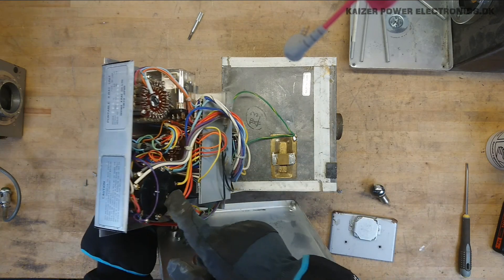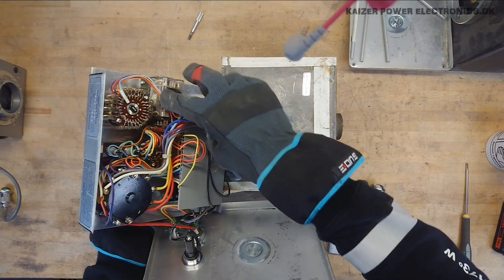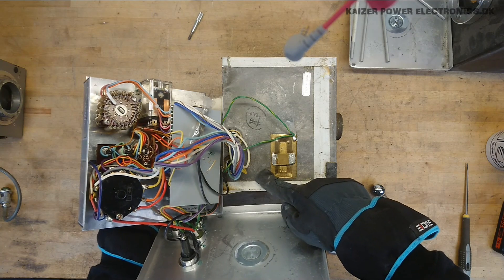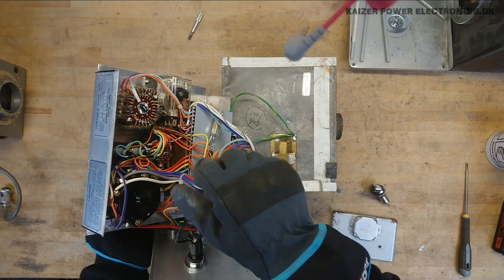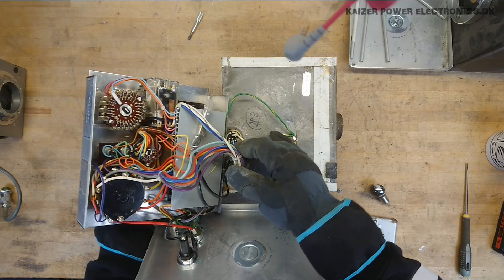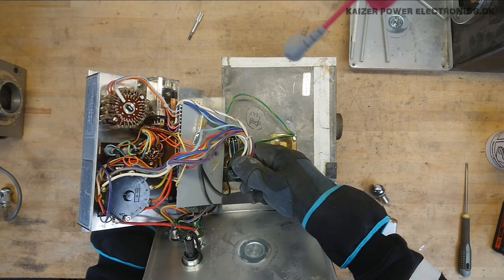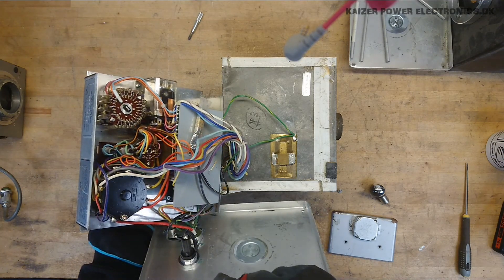At the front we have the unknown selector switch, which seems to be the one with the most tabs going down into the case. That indicates it has to be something with a tapped transformer, whereas the timing circuit only goes down to the PCB. We have a relay sitting there and a small selector switch. I do suspect that this is some kind of voltage selector.